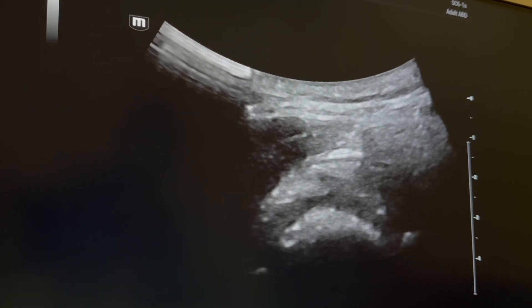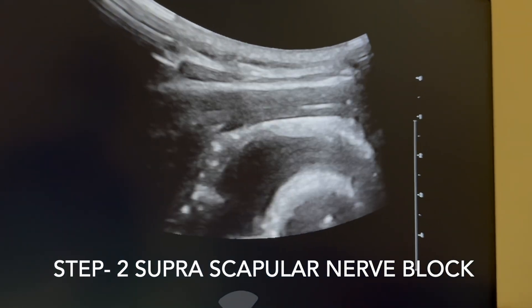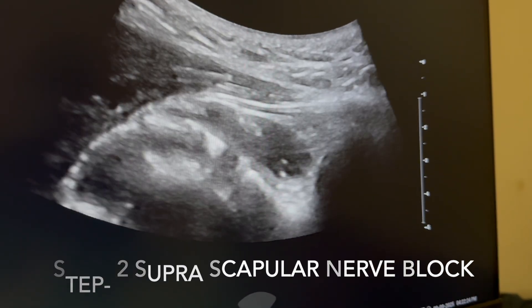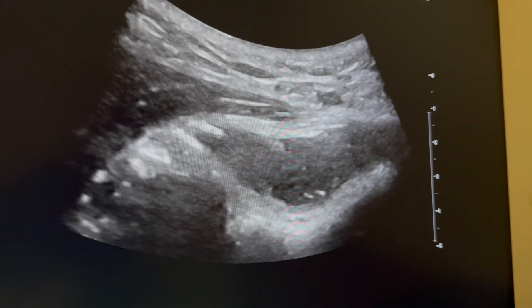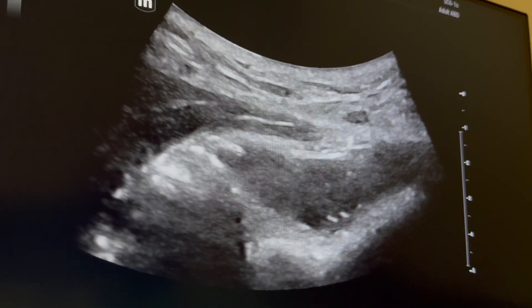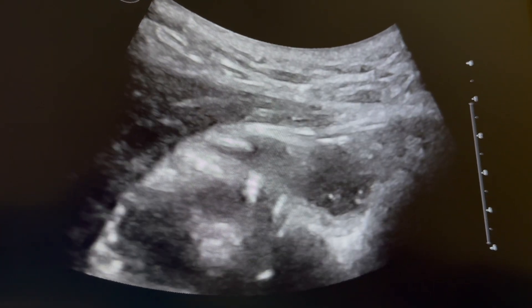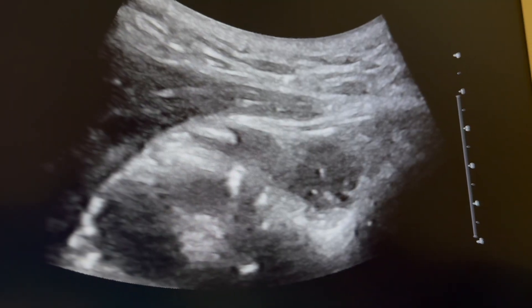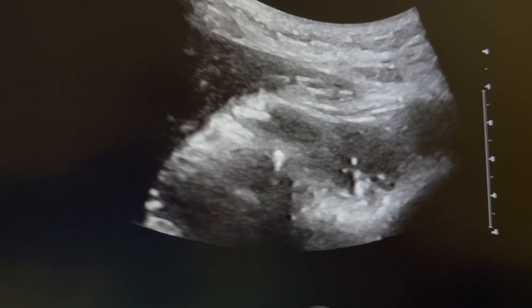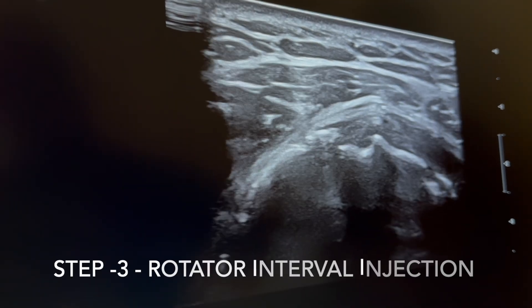Post hydrodistension, a suprascapular nerve block is performed, giving approximately 5 ml of 2% lignocaine with 20 mg of triamcinolone acetonide. Here we can see the suprascapular notch, and the tip of the needle is placed in the suprascapular notch to deliver the block.